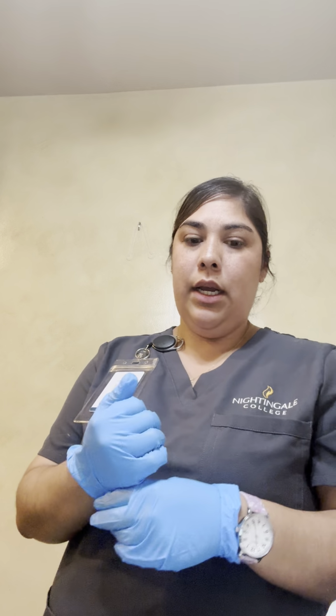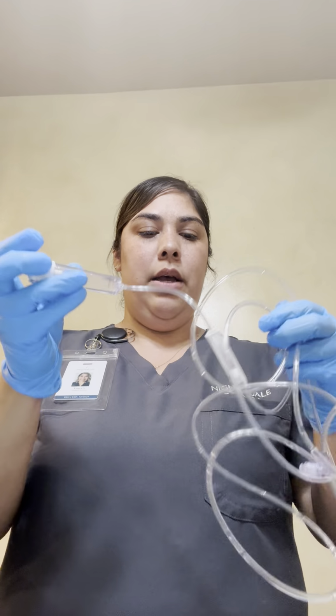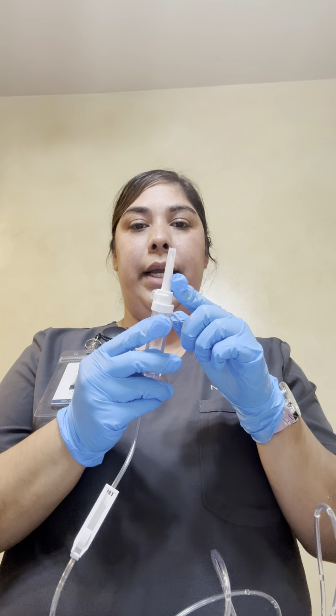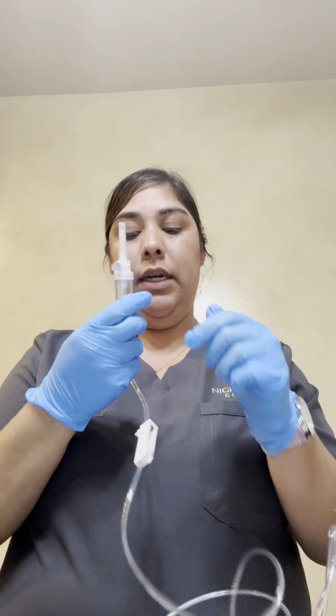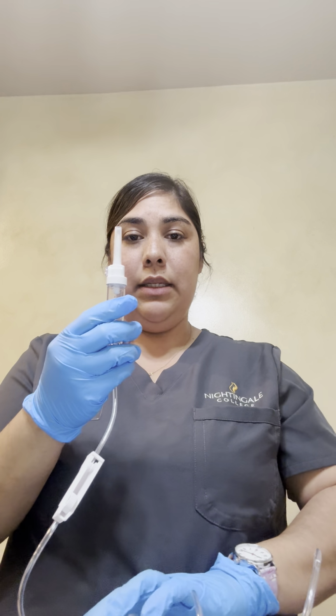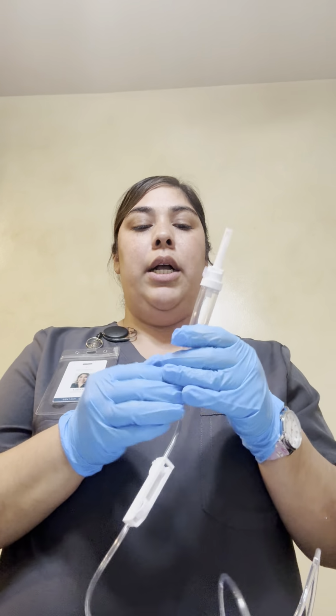Now we're going to demonstrate what we're going to do. This is the main port, the main line, I should say. See, I already touched that. This is my spike. This is sterile. That's why there's a cap on there, because this is going to puncture our bag of medication and our fluids. So that needs to be sterile at all times. We don't want to touch it. We don't want to uncap it until we're ready.